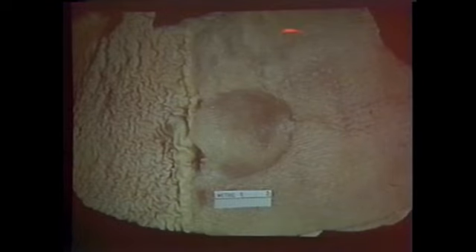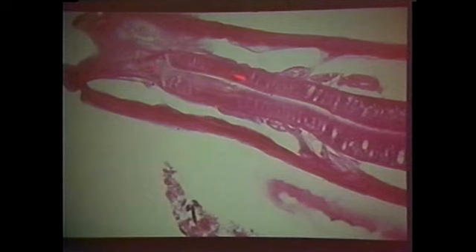Look, there are the embryonated eggs, which we know are characteristic of a spirurid. Here's Draschia. Here it is. Isn't it pretty? Look at that. Coelomyarian musculature. It has lateral alae. What do you think this is? Esophagus. Thank you. Okay, here's the anterior end. It comes in. It doesn't have that rhabditoid esophagus. Well, let's look at this.